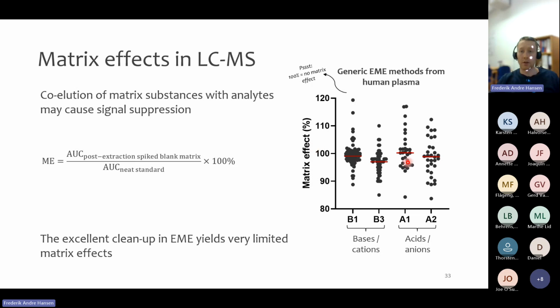And you can see here that for all of the methods, they generally center around 100%, even without internal standard correction. And this is because we get a very good cleanup, so you have next to no matrix effects in the electrospray ionization.